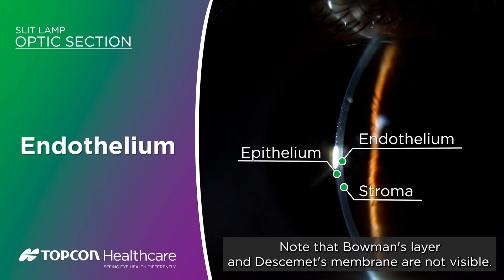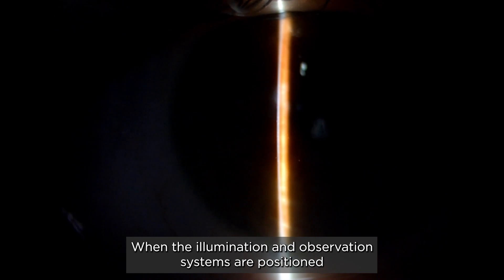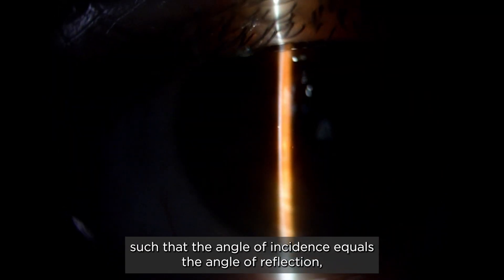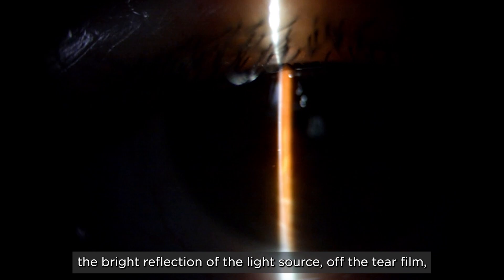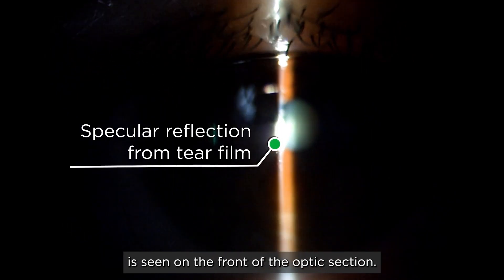Note that Bowman's and Descemet's membranes are not visible. When the illumination and observation systems are positioned such that the angle of incidence equals the angle of reflection, the bright reflection of the light source off the tear film is seen on the front of the optic section.